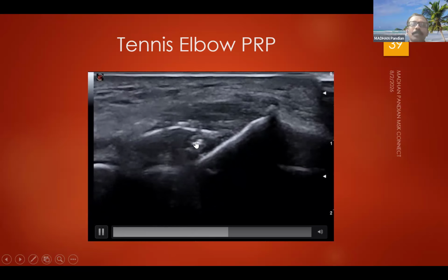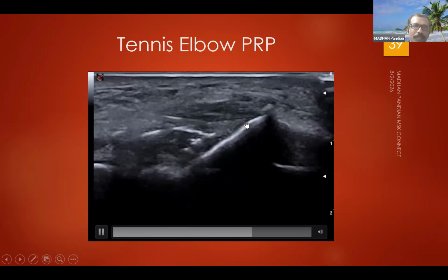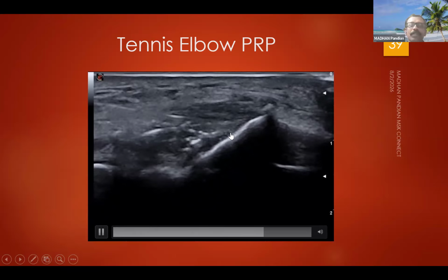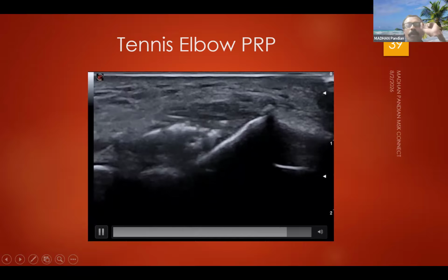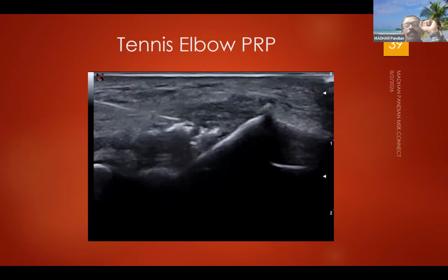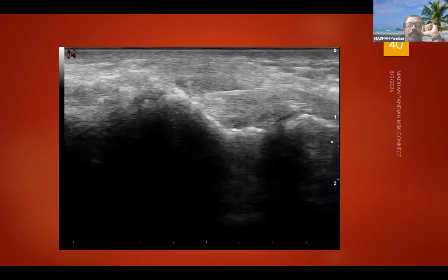Any PRP injection must be given into the substance of the tendon. The entire concavity of this side is the tendon. So anywhere you can do a fenestration, create a new inflammatory focus there, create new angiogenesis, and then infiltrate your freshly prepared PRP there, right?